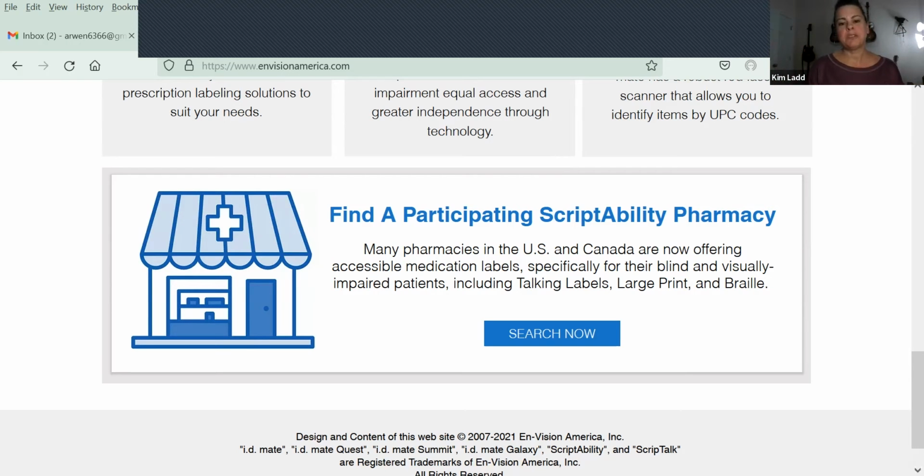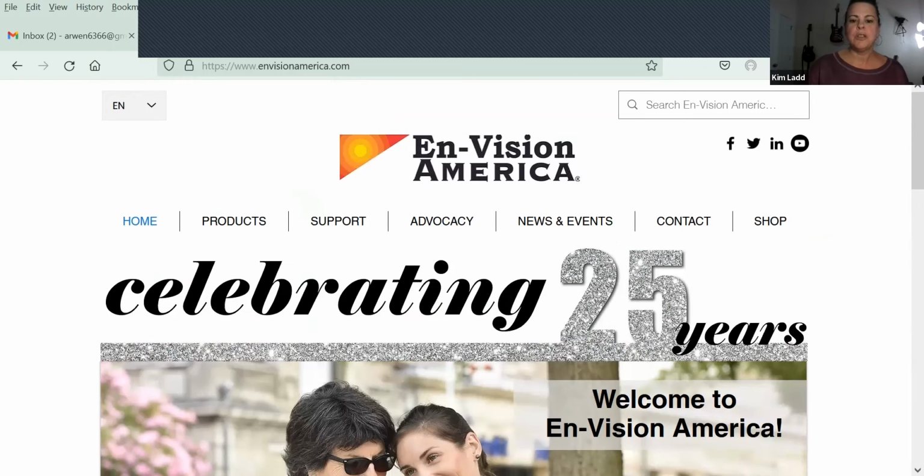So if you ask your pharmacy to sign you up after verifying with Envision America that they participate, what you would need to do is call Envision America and tell them about the difficulty you're having, and they will liaison between the pharmacy and you and help you get set up. And they're very good with that. I've had a lot of good luck calling Envision America. So just to let you know that, I'm going to stop sharing this and go back here. So that's pretty much it about the ScriptTalk. I will reference it a little bit more with some other pharmacies, but that's the main one that I love, just because it's pharmacist based and pretty accurate with everything that they do.